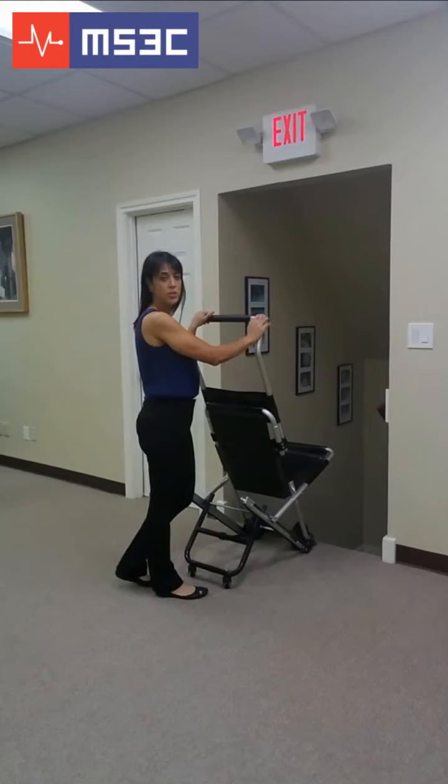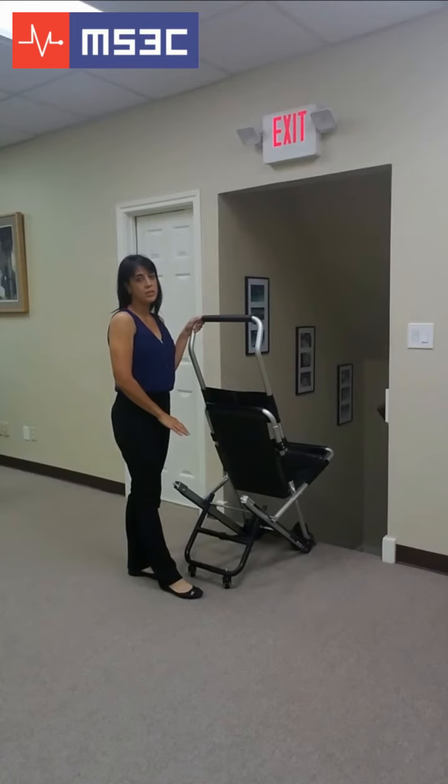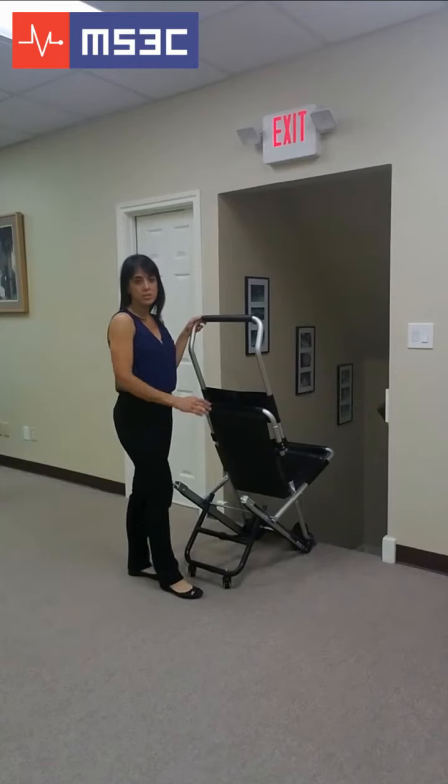Guide your passenger to the top of the staircase. You will need to disengage the rear wheels in order to descend a flight of stairs. To do so, tilt the chair slightly forward and push on the black bar until it locks into place.